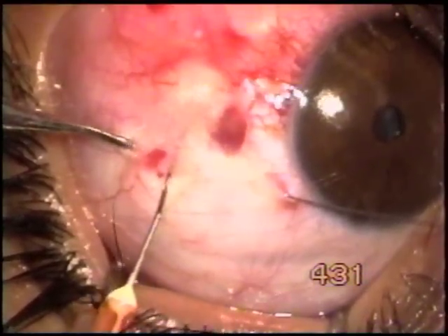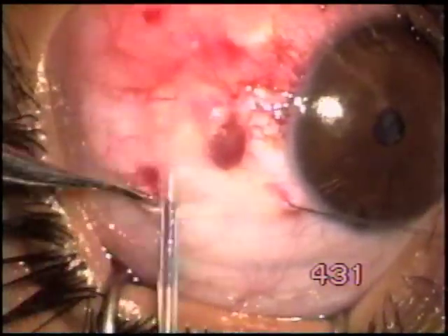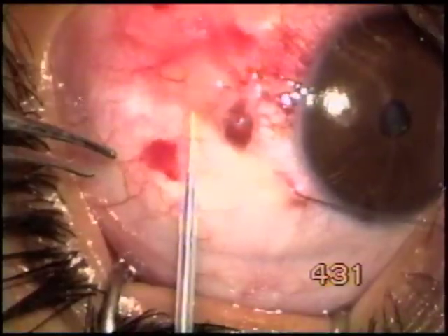Now we make a hole in the conjunctiva in the similar fashion as before, and balloon the conjunctiva with sodium hyaluronate.